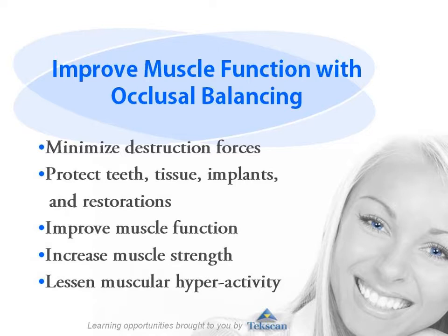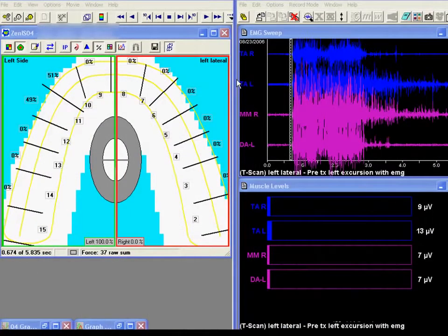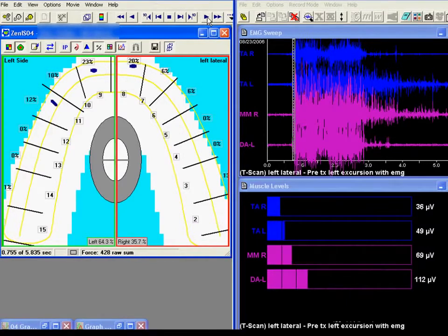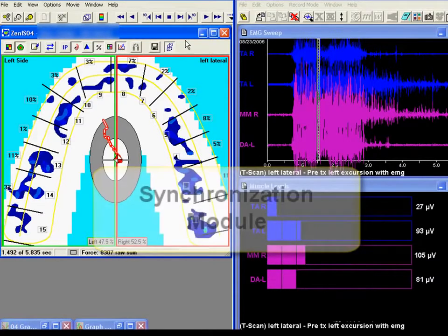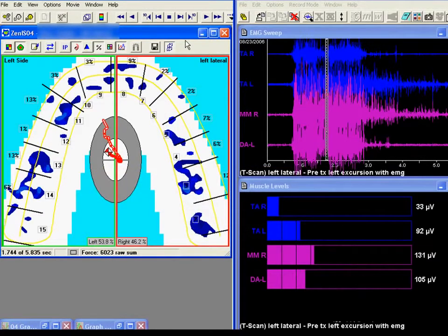Functional movements can also be measured, allowing you to lessen muscle hyperactivity in excursive functions by employing disclusion time reduction therapy. Reducing the disclusion time is an occlusal adjustment procedure that is very different from equilibrating. The goal of the procedure is to shorten the time it takes for the patient to disclude in a measurable time frame of less than 0.4 of a second.